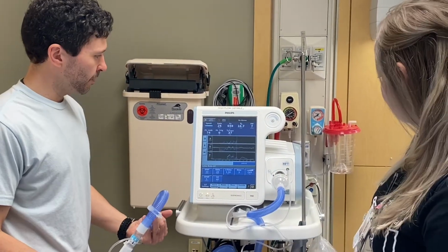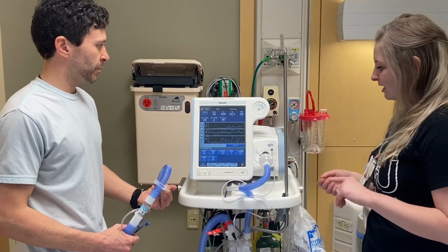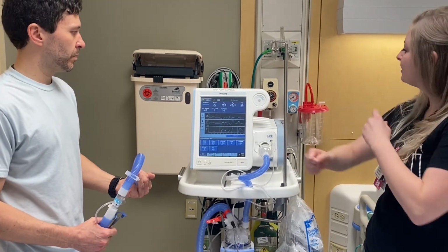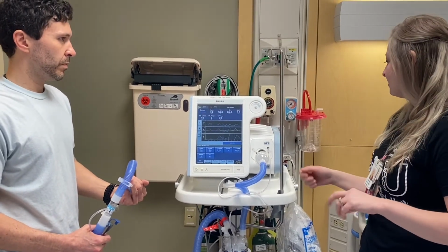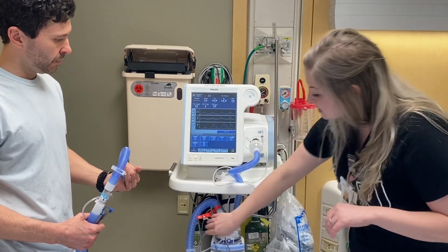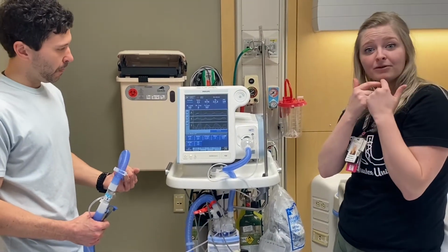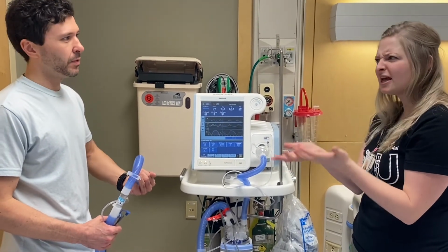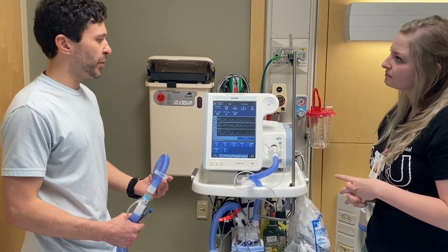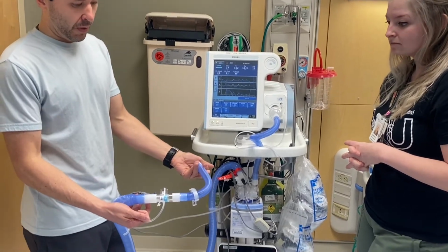But other issues that might occur for troubleshooting. Say I come in, the machine's alarming, we check for this tube. You would also check these tubes to see if they're kinked. You check the seal of the mask around the patient. What other things could you do? Really, there's not much to it aside from your pressure lines and your actual tubing up here. There's really not much else.